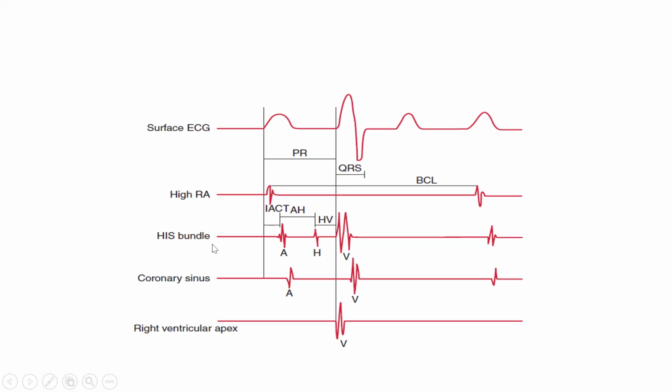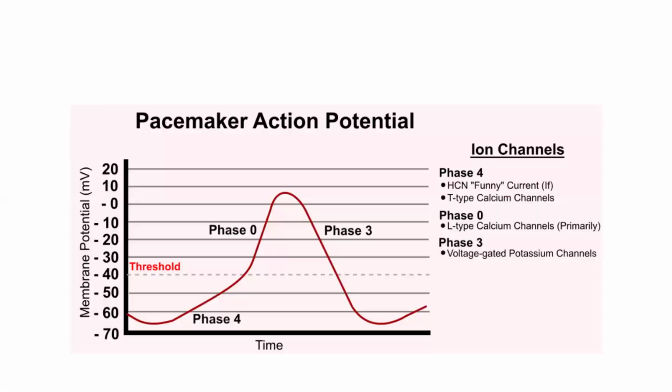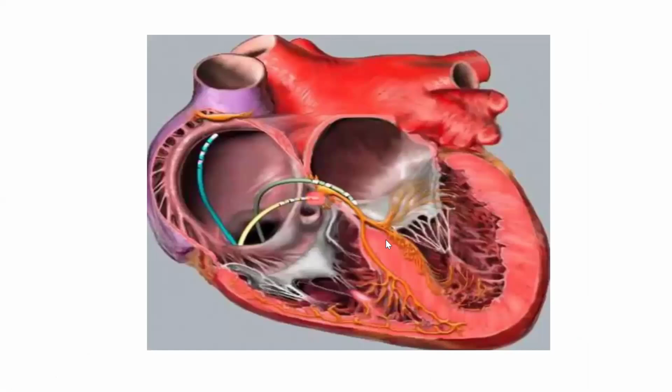Now, the His catheter, we also said, can be divided into proximal, mid, and distal, or you can make it a single reading. Remember we said the His has a proximal end sitting in the right atrium, a portion touching the His, and the distal end sliding into the right ventricle. So just the same way, I'll go back to this His catheter again.